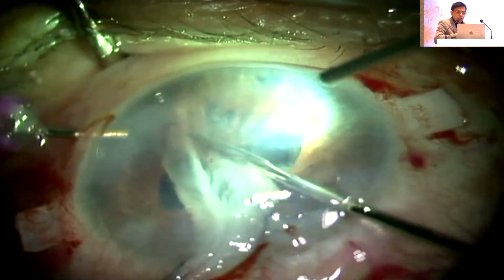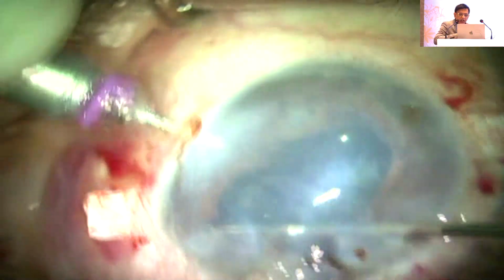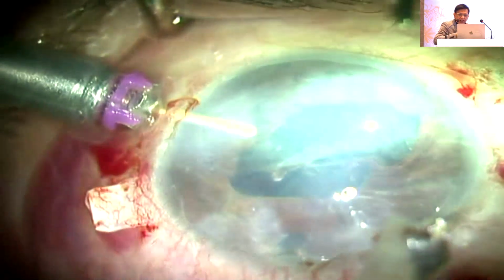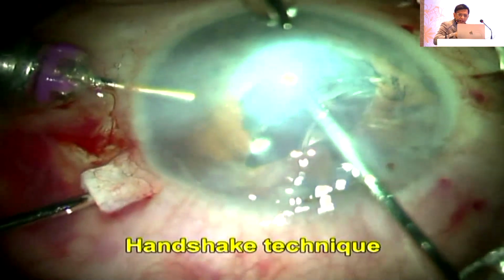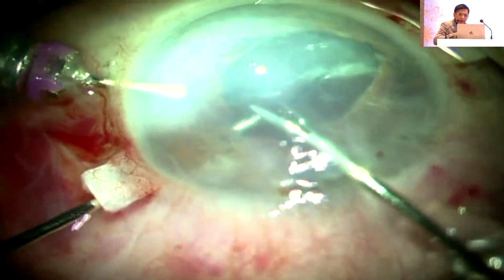I'm cutting the whole structure there, removing it en bloc. Now you see inside, as I remove that structure, I'm seeing there's something shining inside. And you can see that's a subluxed IOL. So I catch it anywhere. Luckily for me, it was a 3-piece IOL. Do a handshake technique, and I made my flaps there.